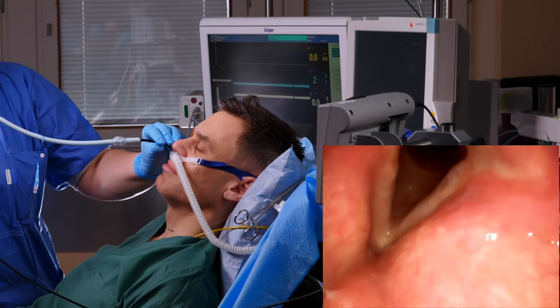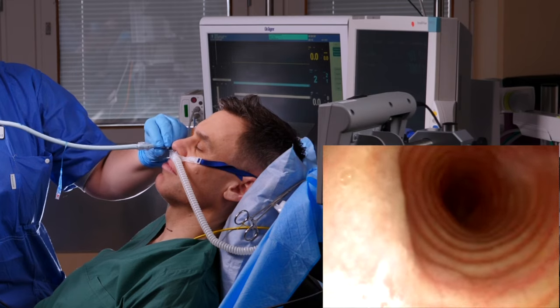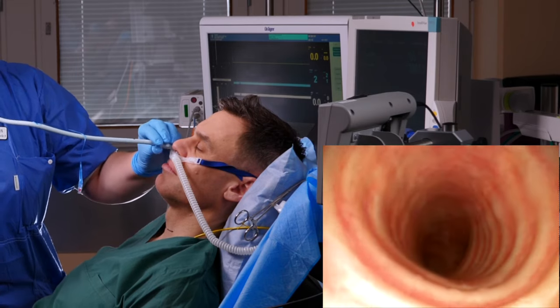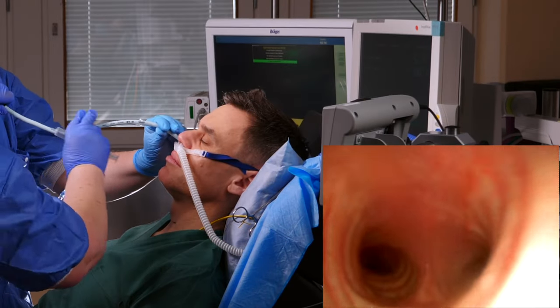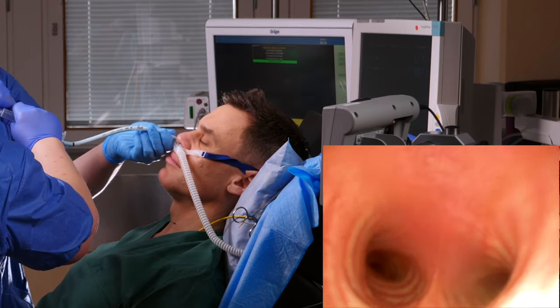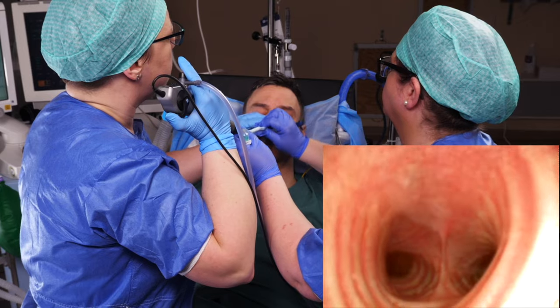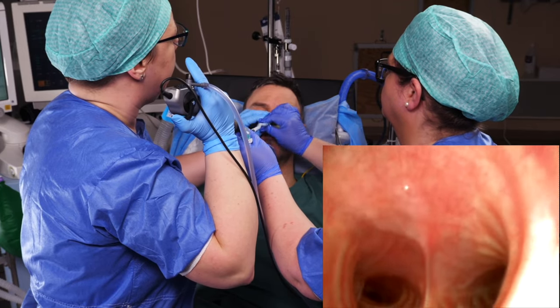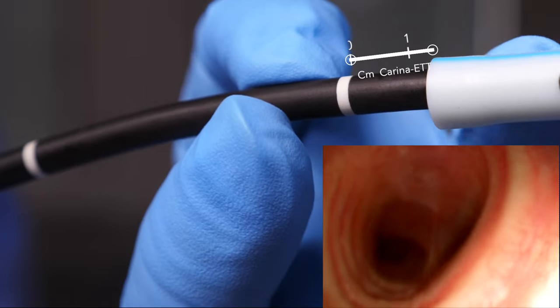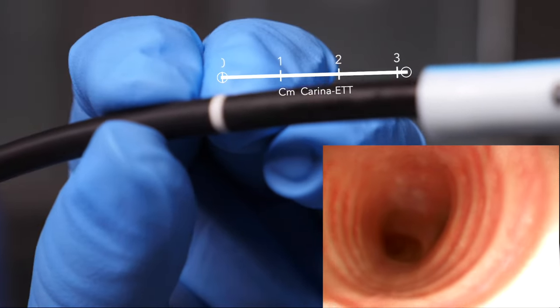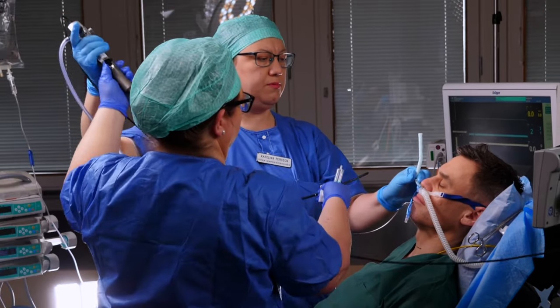Remind the patient that they may experience coughing as you are entering the trachea. Make sure that you see the tracheal rings and proceed until you see the carina. Now hold the bronchoscope firmly as the assistant advances the tube, railroading it into the trachea. A rotation may be required as you advance. This is a good time to remind the patient that they will not be able to speak beyond this point. Once the tube is in the trachea, confirm the position by grabbing hold of the bronchoscope just over the end and retracting it from the carina until you see the tip of the tube — it should be about 3–4 cm. Firmly hold the tube in place as you remove the bronchoscope and reattach the connector.